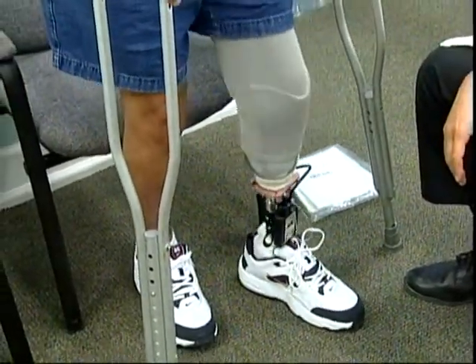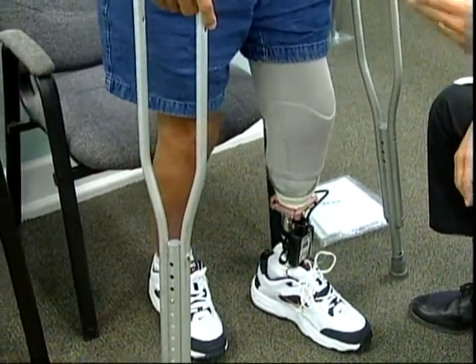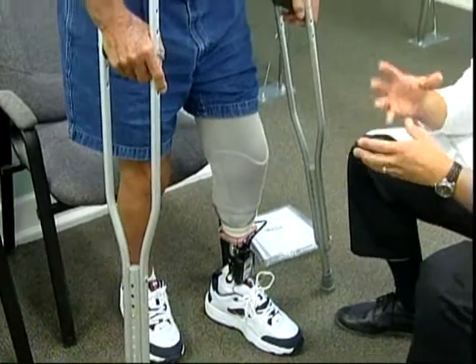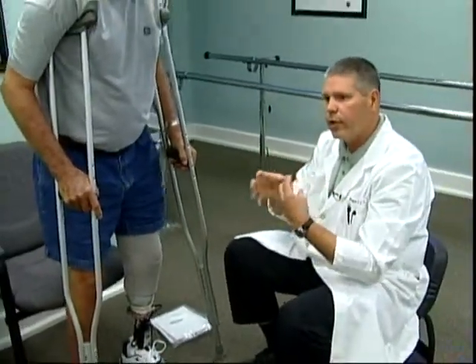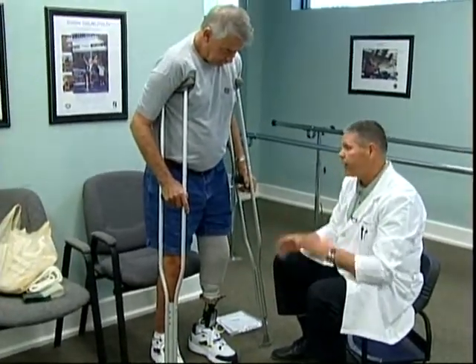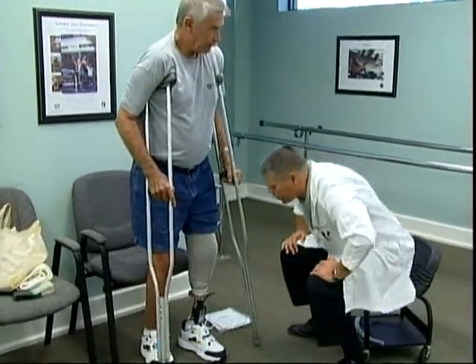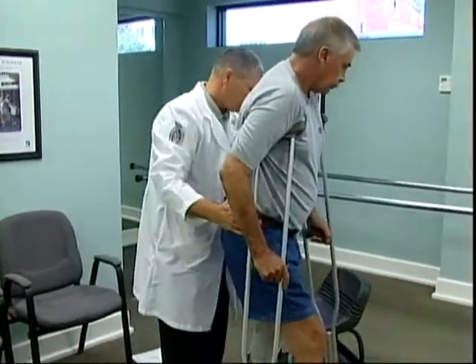Right. When I move my knee, the foot moves. Previously, when he was in a locking system, which we started him out with initially because of the expected volume changes, he could feel his limb moving inside the prosthesis. Now it's really attached to him. So now at this point, we're ready to get over between the parallel bars and do some alignment and get this thing correctly aligned for him.